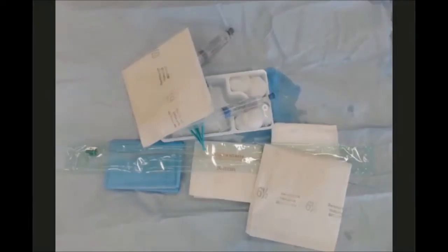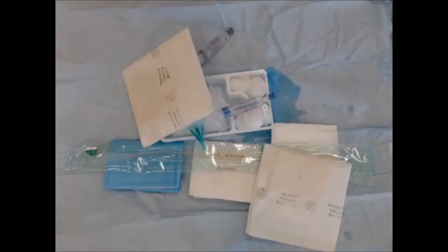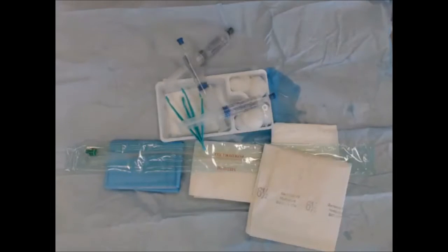Now that everything is ready, go and wash your hands using a full sterile hand-washing technique, then come back to the patient and put on your gloves. It's important to note that you should also be wearing an apron at this point. Once your hands are properly washed and your apron is on, put on the first pair of sterile gloves.